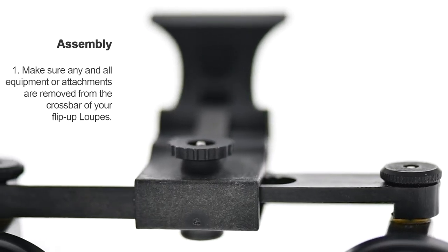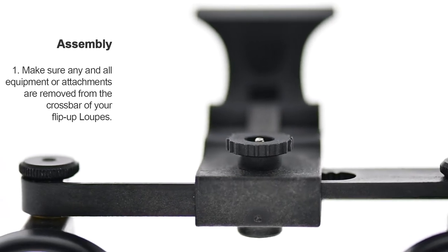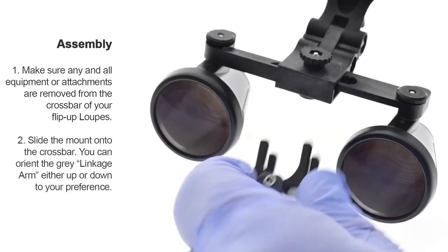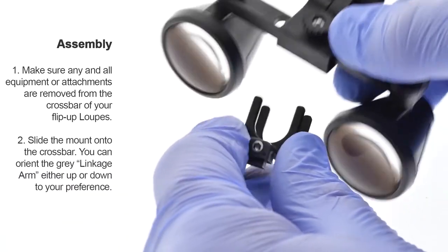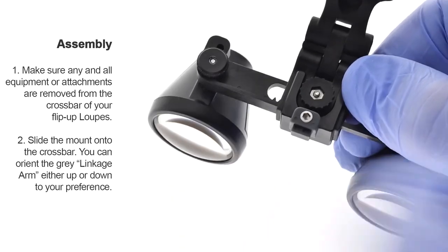Make sure any equipment or attachments are removed from the crossbar of your flip-up loops. Slide the mount onto the crossbar. You can orient the gray linkage arm either up or down to your preference.